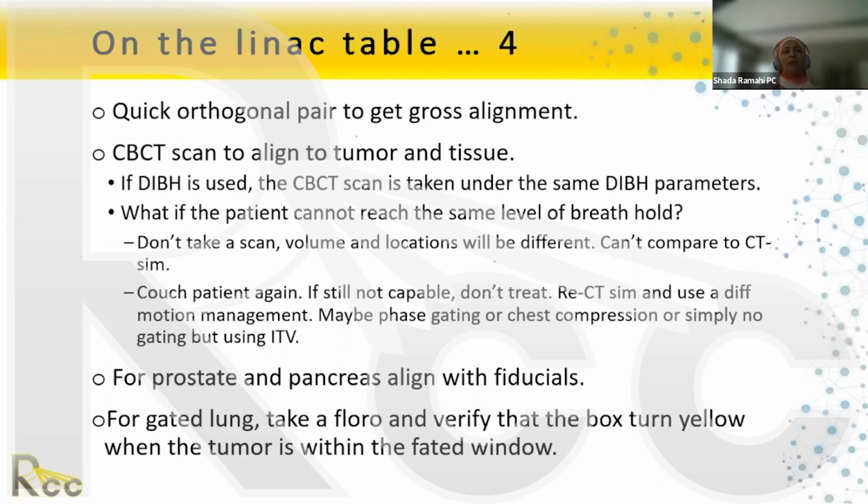Only one patient that we had to re-CT sim in the last 5 months, I think. And for some reason, the gas buildup was permanent. Even after we asked the patient to go back home, come back again, and not to eat gassy foods and so on, the patient consistently had way more gas in the abdomen daily relative to the CT sim. So we figured something changed in the patient's life, now that they have a lot of gas buildup in their abdomen. So we had to re-CT sim.